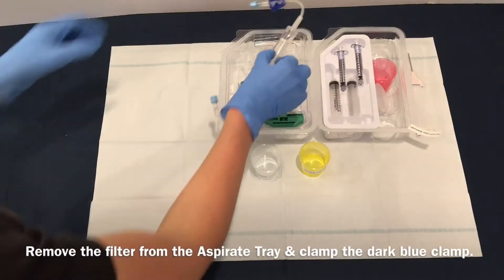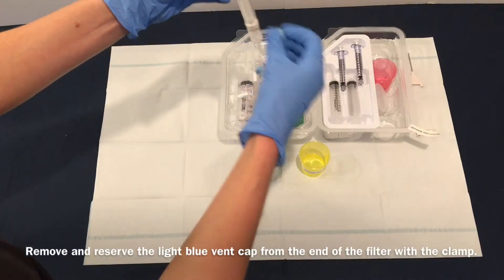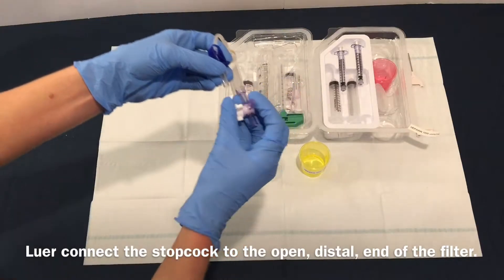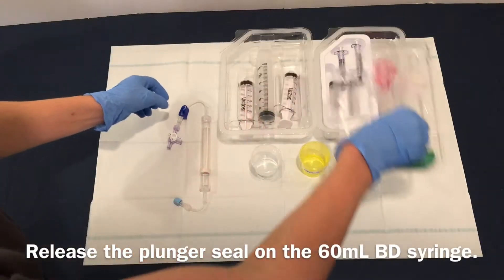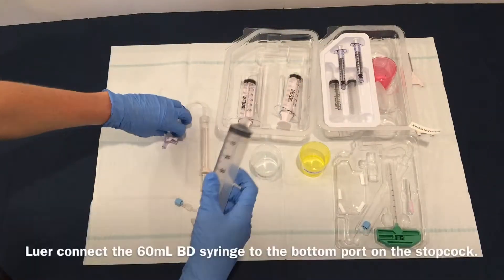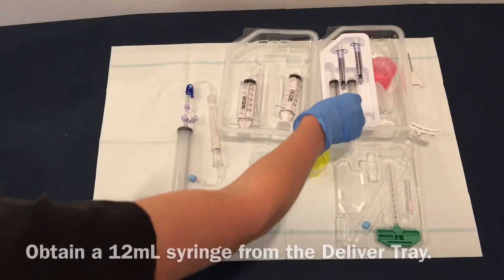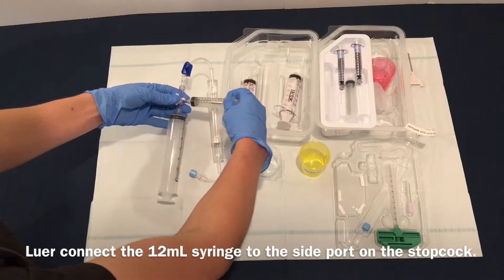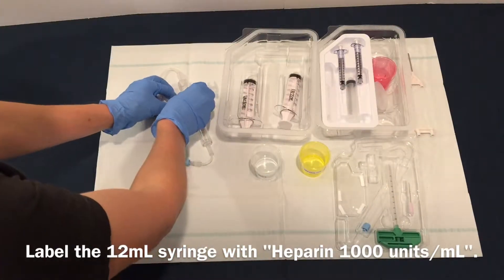Remove the filter from the aspirate tray and clamp the dark blue clamp. Remove and reserve the light blue vent cap from the end of the filter with the clamp. Luer connect the stopcock to the open distal end of the filter. Release the plunger seal on the 60 mL BD syringe. Luer connect the 60 mL BD syringe to the bottom port on the stopcock. Obtain a 12 mL syringe from the deliver tray. Luer connect the 12 mL syringe to the side port on the stopcock. Label the 12 mL syringe with heparin 1000 units per mL.